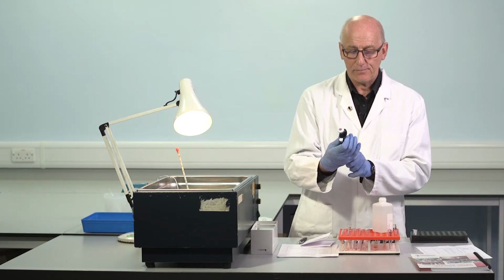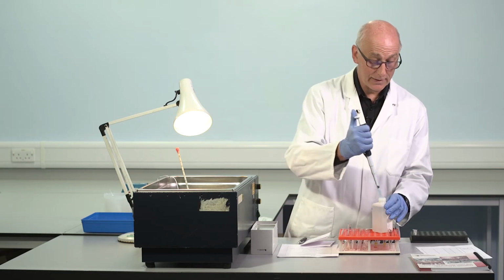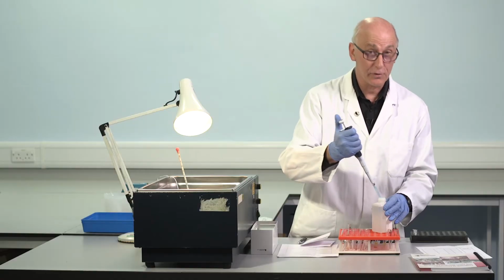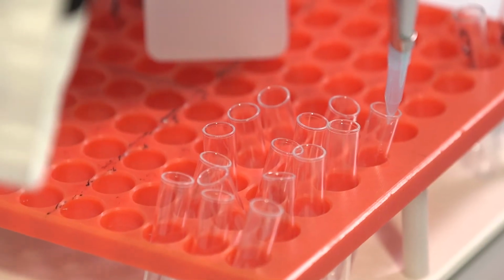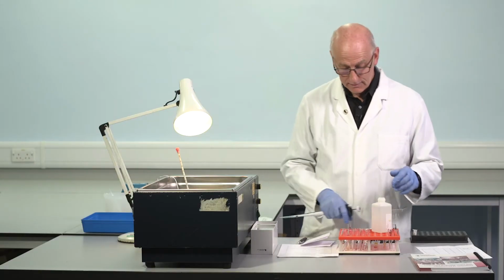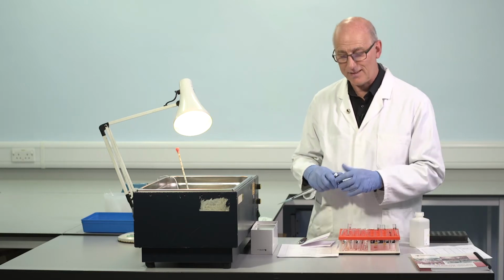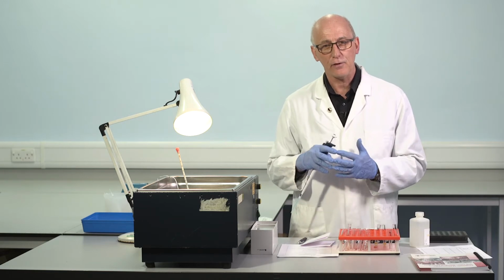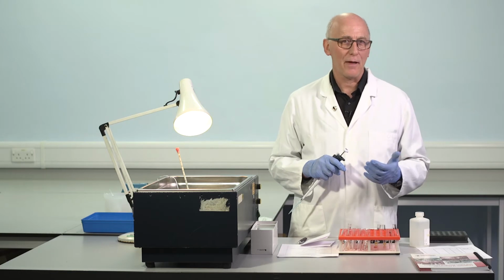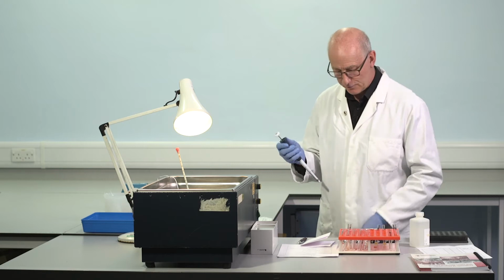The tubes that we're using, it's important that we select tubes which have no impact on coagulation, and this is more likely if we use plastic than if we use glass. These tubes should not be reused. It's very difficult to clean plastic or glass tubes which have been used in this way and reuse them for this type of work, because we noticed that even very small amounts of residual detergent used in cleaning can really have an important effect on the clotting times which we obtain.